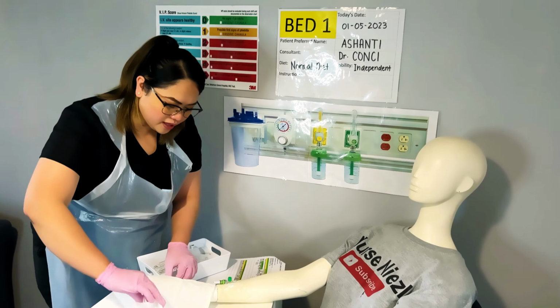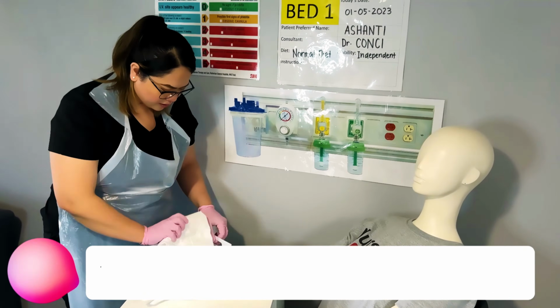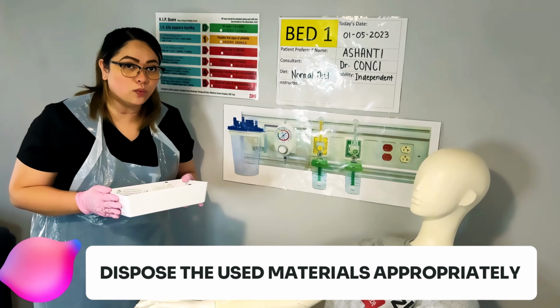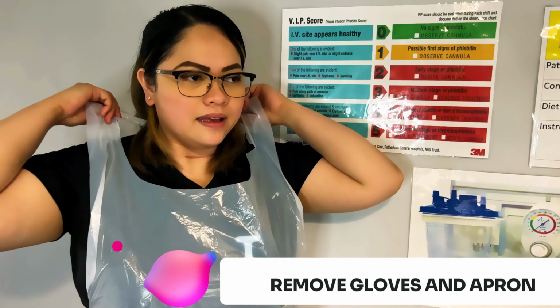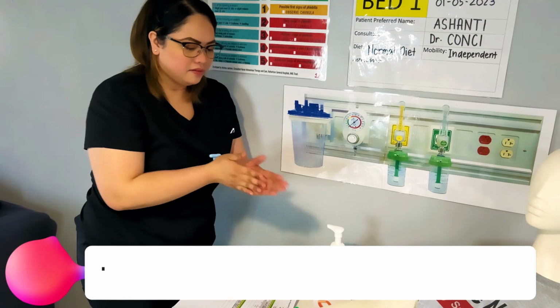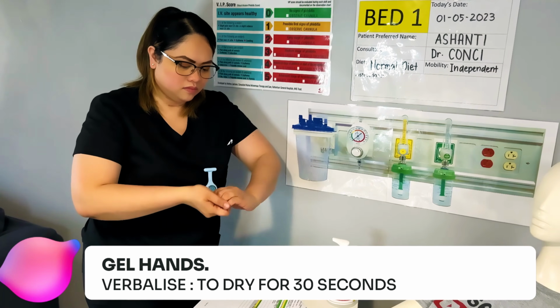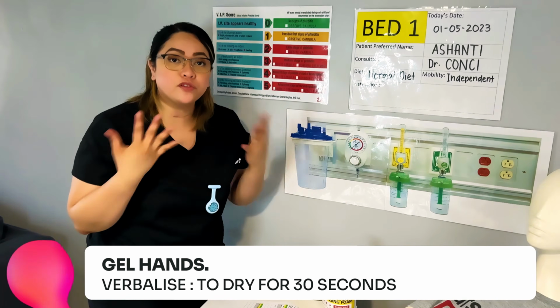Okay, now I'm going to remove the drape. Are you alright? Yes, I'm okay, nurse. Everything on my tray is disposable, including the tray, so I'm going to put it in the clinical waste bin. And my gloves. Remove my apron. Next is to gel my hands. Then let it dry for 30 seconds.